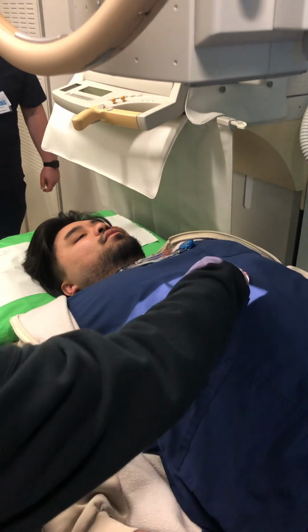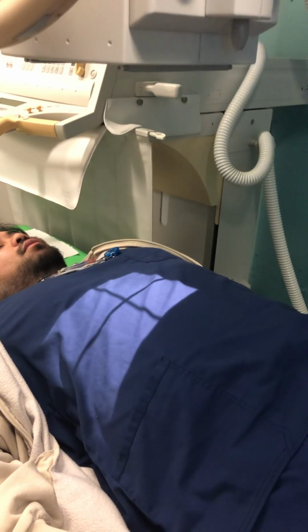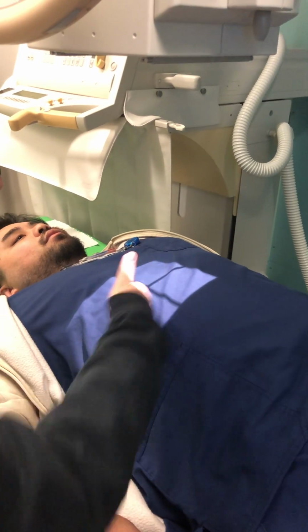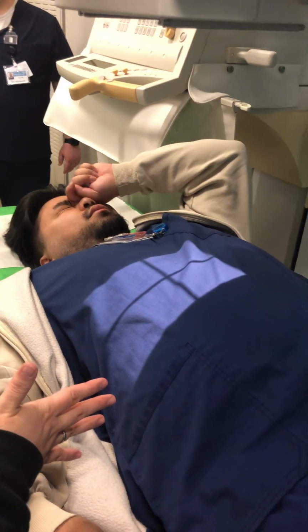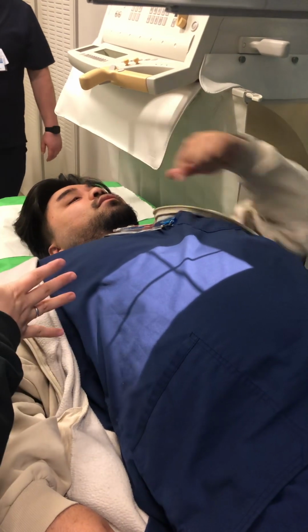Have you ever had to radiograph the false ribs on the sides? So this is for your false ribs. Because again, the lower ribs do not connect. So this is for those ribs, which is why it is a lot smaller than the upper ribs.